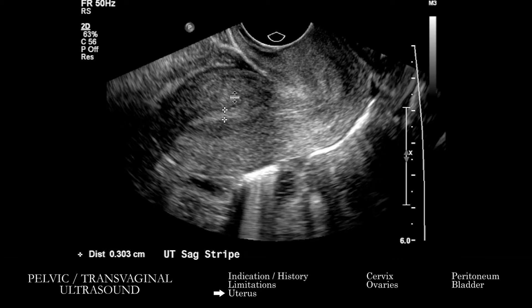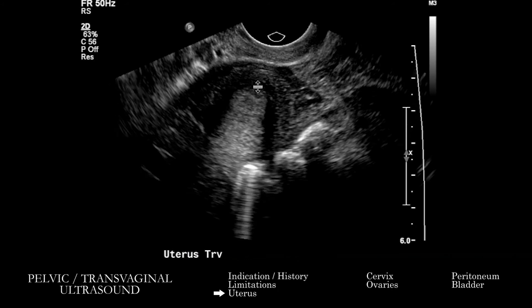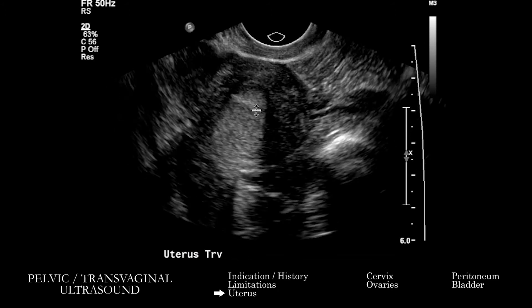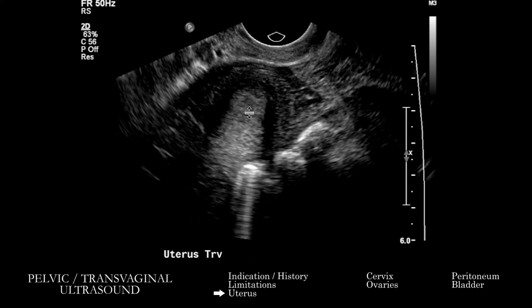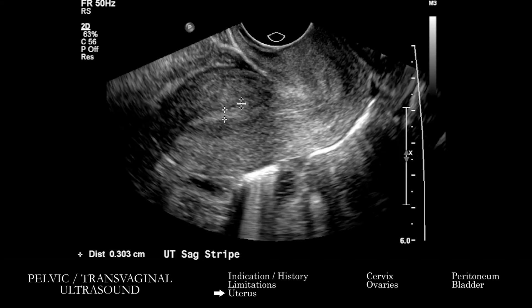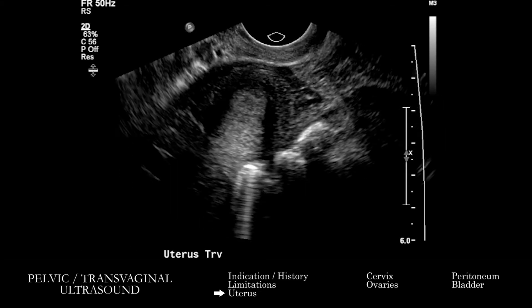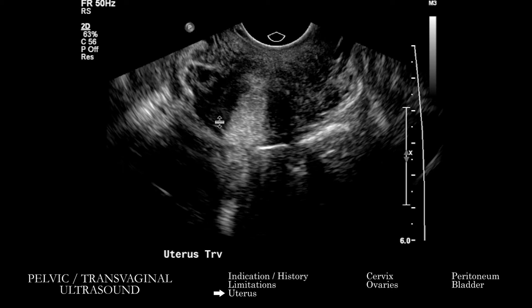We're also going to look at the endometrium. You want to understand its thickness relative to the patient's premenopausal or postmenopausal state. This thickness is the double thickness — you're measuring it from both sides. If there is fluid, you want to make sure to exclude that. We're going to look for focal lesions within the endometrium and intracavitary lesions. If there is an IUD or any sort of implant, you want to check its positioning. On each of these images — these are just the grayscale images — but if we do find an abnormality, it's especially important to correlate with color Doppler to see if there's flow in it.